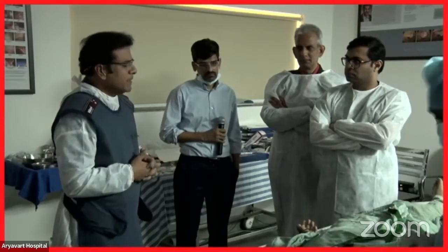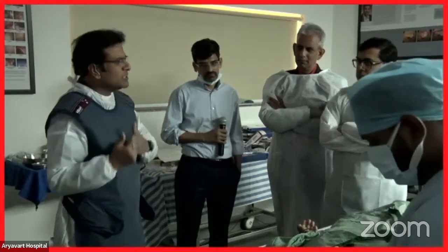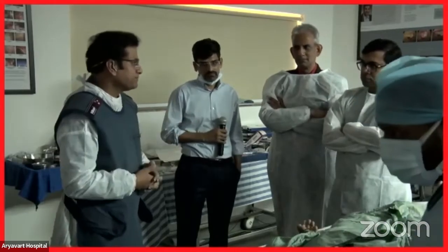Usually it's somewhere in the distal body or antrum region, where you see the stent deployed. The part of the bowel nearest to the stomach is my target.